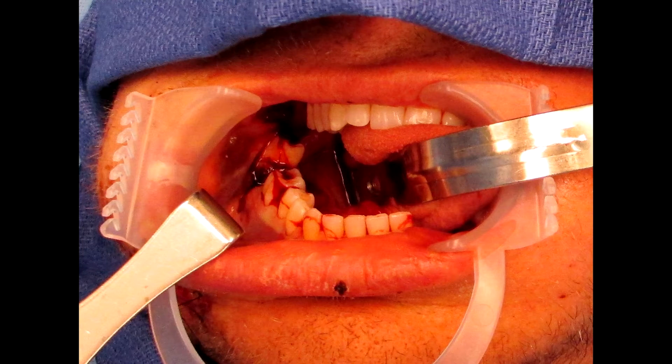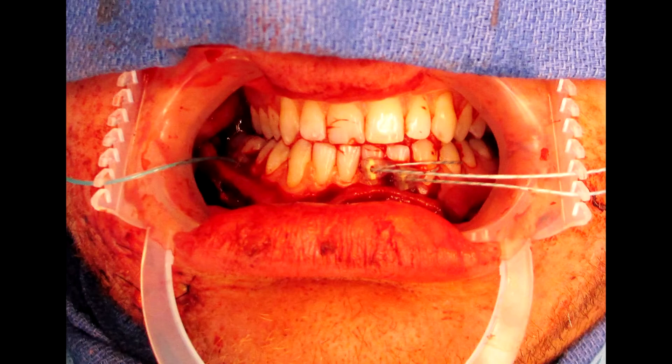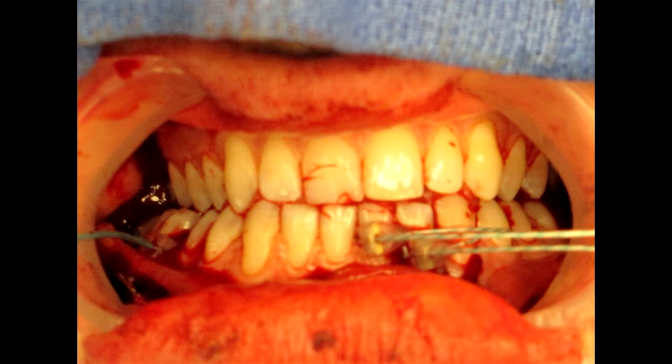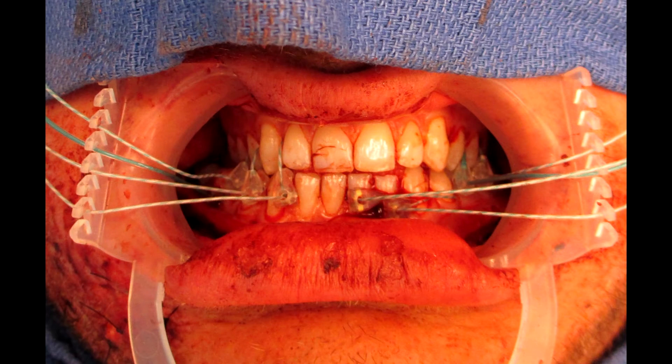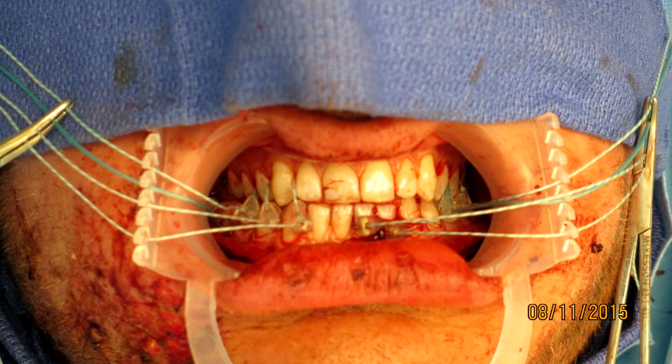The patient had a flail segment of his mandible and two step-offs between his mandibular dentition as shown in the pictures. First, mini-ties were applied in a bridle wire style fashion to reduce the fractures. Standard mucosal incisions were made to further visualize the reduction of the fractures. Next, maxillomandibular fixation was achieved by looping the devices through the maxillary dentition and the mandibular dentition and securing the devices as shown in the previous demonstration.